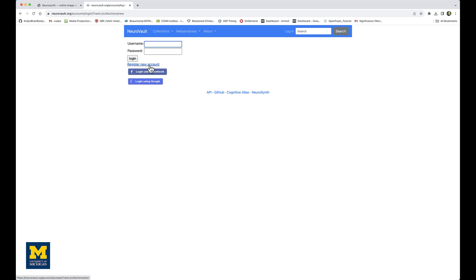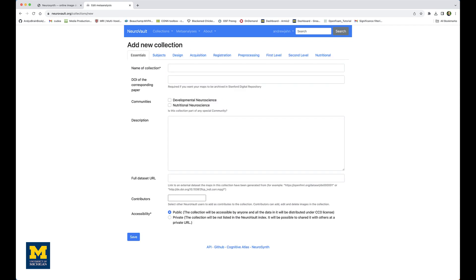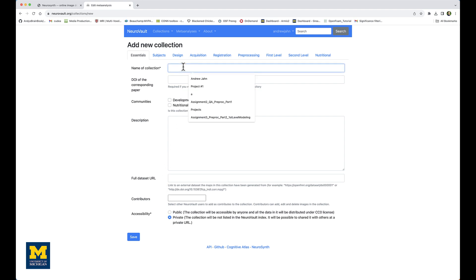If you don't have an account, you can register one here. In my case, I already have one, so I'm going to log in with my credentials. Because this is a dataset I downloaded from openneuro.org and I'm not going to publish it, I'm going to make the accessibility private because this is for demonstration purposes only. I will then give this collection a name, such as 'Flanker inc-con.'